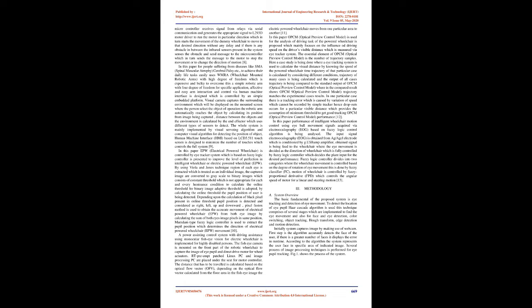A dummy wheelchair is controlled via iris movement using digital image processing in MATLAB. The whole system is divided into two parts. First, the eye image is captured continuously using a web camera which is mounted on the helmet. The captured image is processed using digital image processing, where an edge detection technique is incorporated to calculate the position of the iris and also to calculate the distance to be moved in that particular direction. A motor is incorporated to control the movement.